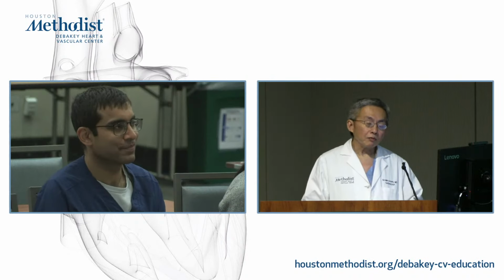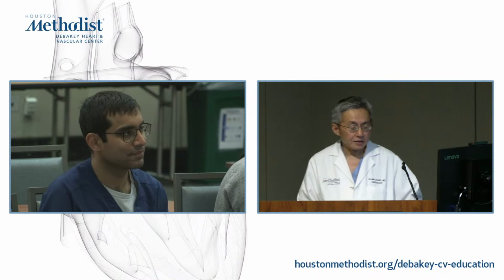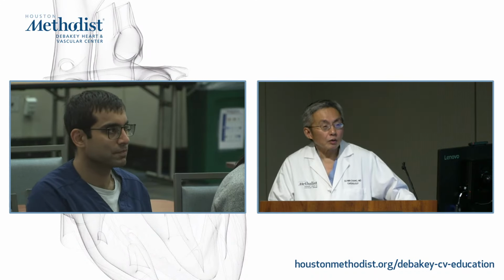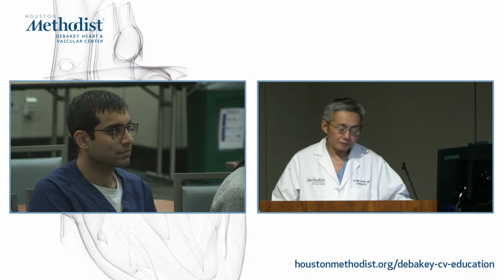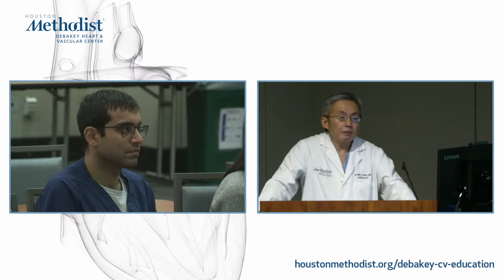As I mentioned, CT is very good without contrast to look for fat, air, water, or calcium. If you want to know that, and the pericardium will be the best case, right? That's why most of the time we do non-contrast for any device, right? If you have a prosthetic mechanical valve, you don't need to give contrast.